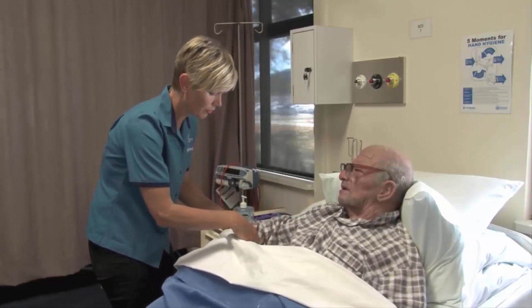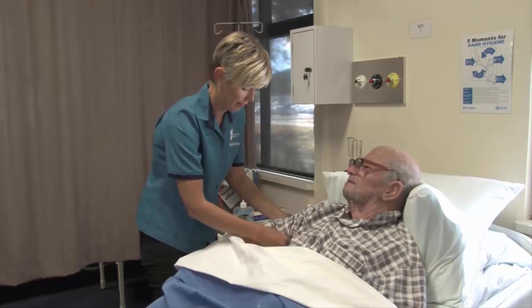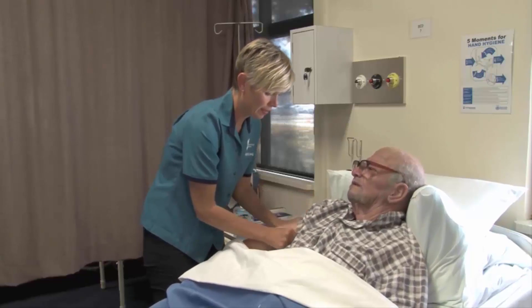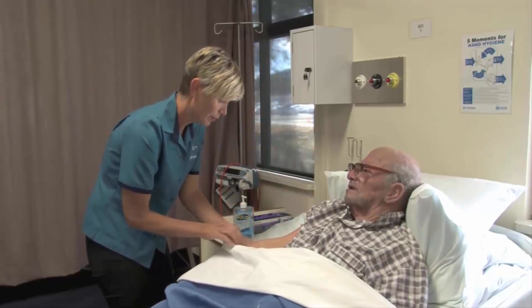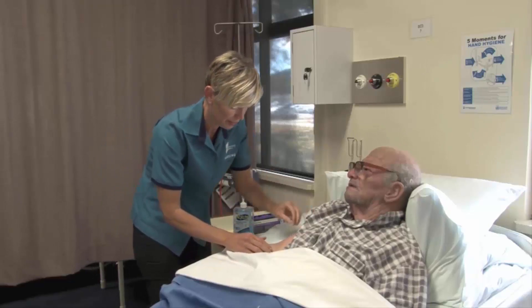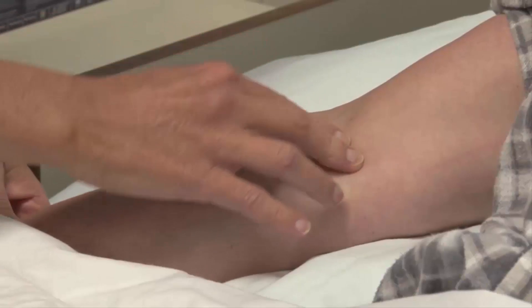Now I'm going to need you to roll your pajama top up. You shouldn't take the blood pressure over the top of pajamas or dressing gowns — that gives a false reading. Just bring that up a little bit so I can fit the cuff on your arm. I'm just going to turn it over because I need to be able to feel the brachial artery — this is where I'm going to take your blood pressure from.